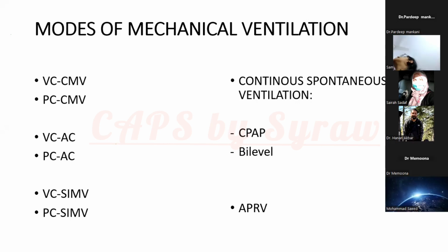So the pressure is regulated within the set values that we put in the ventilator, and we will set a target tidal volume. We do not set an exact tidal volume. We will set a target tidal volume, and the vent will sense the changes in the patient's lungs, and then there's a closed loop.